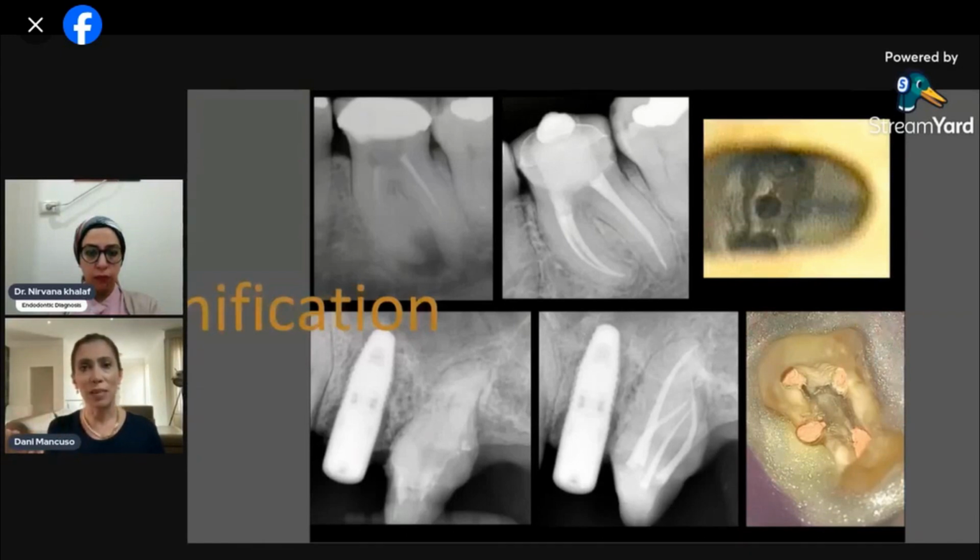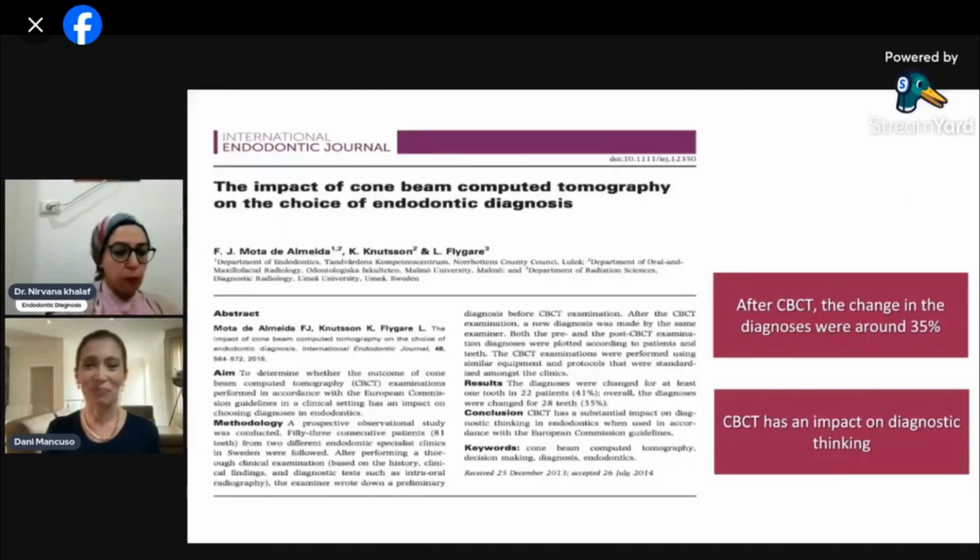If you look in the CBCT and you find different canals, you can go with your magnification and find inside the tooth, for example, three mesial canals in the lower molar or an awkward MB2 in the upper molar. And I'm amazed with magnification as well, because nowadays we can find lots of canals that we didn't know existed. And I like this article because it happened to me.